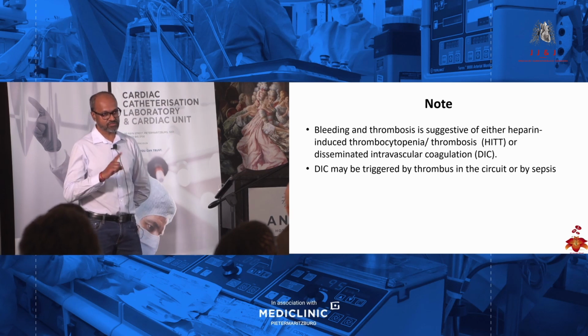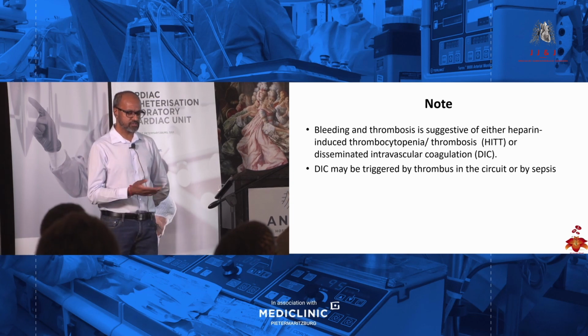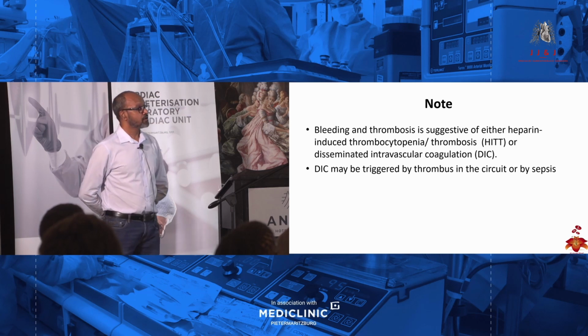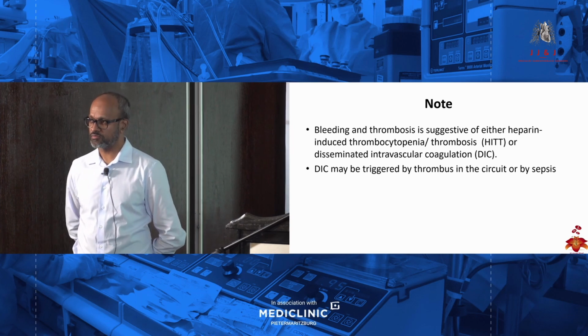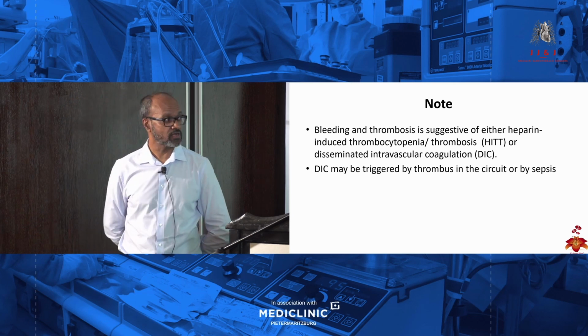Obviously, sometimes the circuit has heparin in it. So we stop heparin, change to Arixtra, and see how the patient does. If the platelet count is not increasing, change the circuit to a heparin-free circuit and then continue. But we do know that some normal patients not exposed to heparin can also test positive for HIT antibodies, so the specificity of these tests is not so high. Next slide.